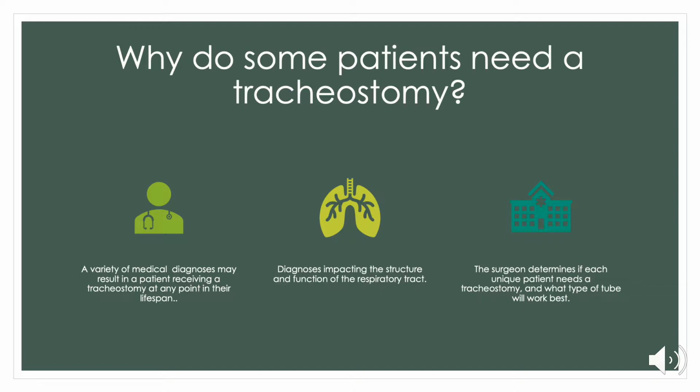There is a range of etiologies that may cause an individual to need the placement of a tracheostomy tube or a ventilator to help them breathe. A person may need such a device at any point in their lifetime, namely if a medical diagnosis impacts the structure and/or the function of their respiratory tract.